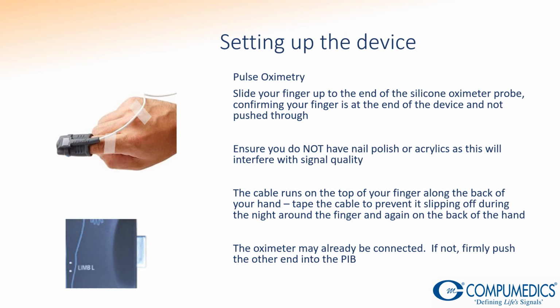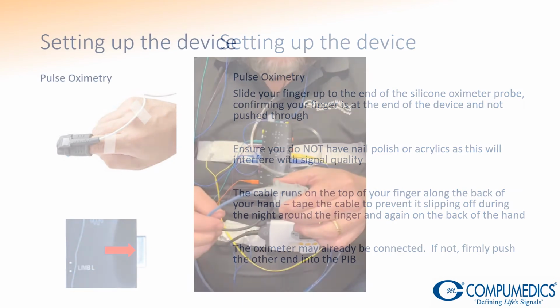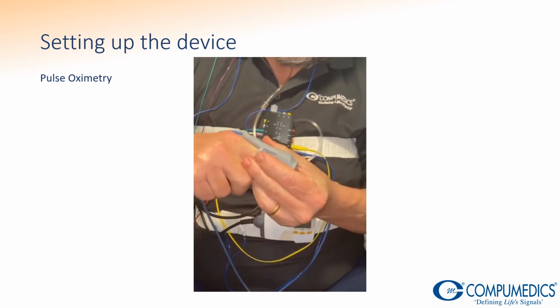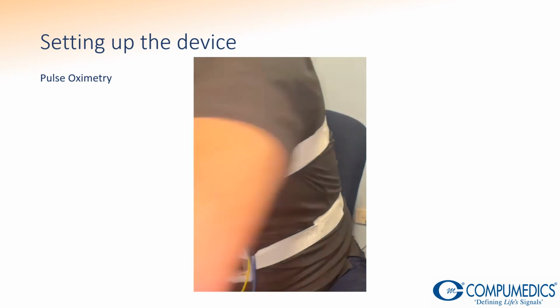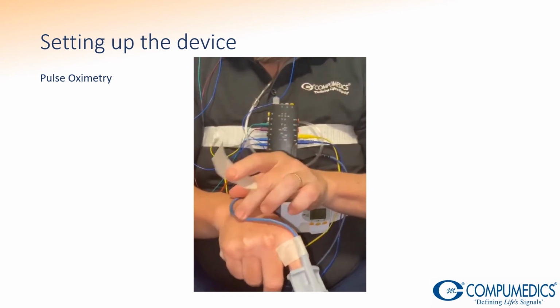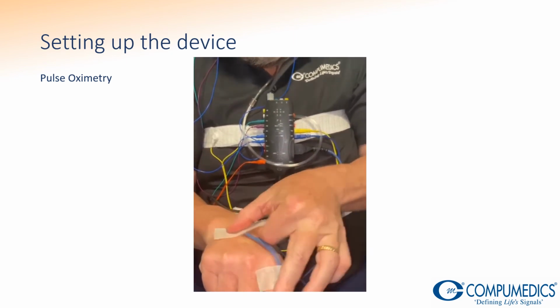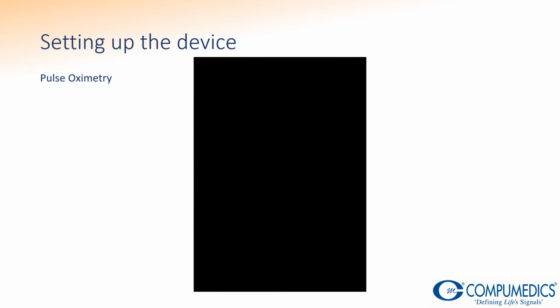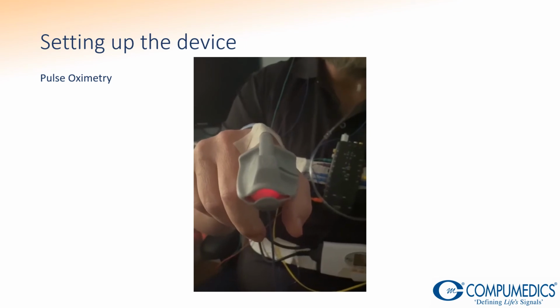The cable runs on top of your finger, along the back of your hand, with tape placed around the finger and again on the back of the hand to help secure it. It may already be connected. But if not, firmly push in the other end into the PIB as shown. When the device is recording, you will see a faint red light coming through the end of the probe.